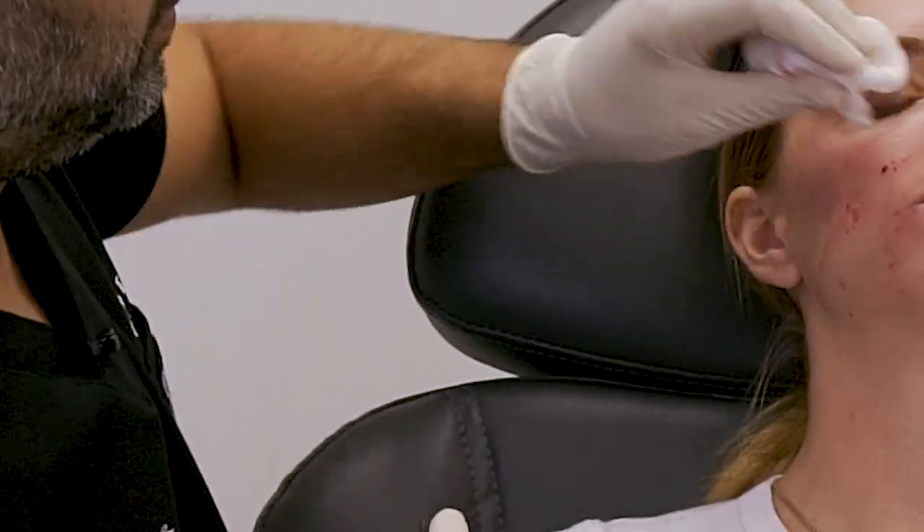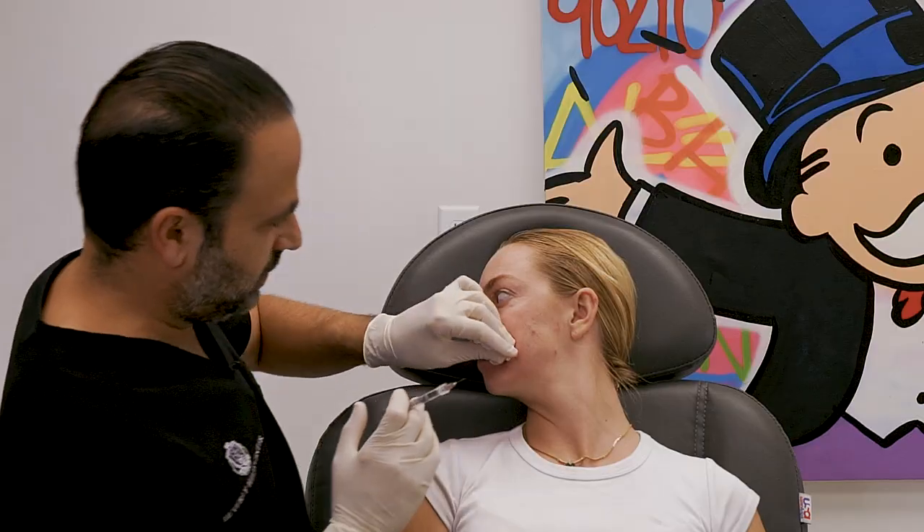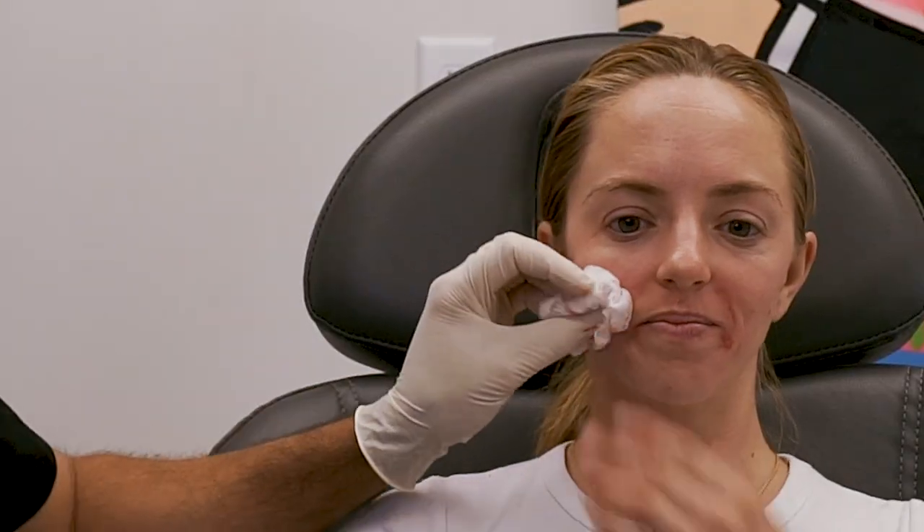Acne scars are atrophic scars — little cysts that eroded and lost their dermis. This just helps give a little hydration back to them. You can see how it pours out because there are little tiny holes in the skin. Deeper acne scars can improve like this. It's actually one of the remaining FDA indications for fillers — acne scars — because it's already damaged skin.